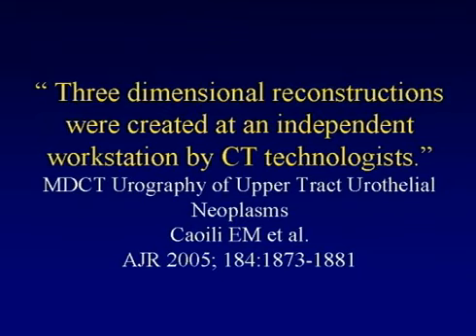And we have the best technologists at Hopkins, but there's no doubt that if you want to read a CT of the kidney, you don't want to be reading the 3D maps that were generated by somebody else. It's not the technologist. I wouldn't look at the 3D that was generated by one of my other radiologists at Hopkins, and they, of course, never miss anything.